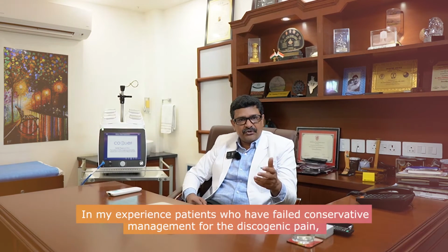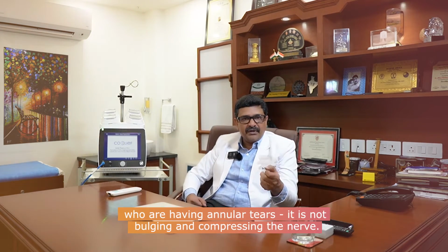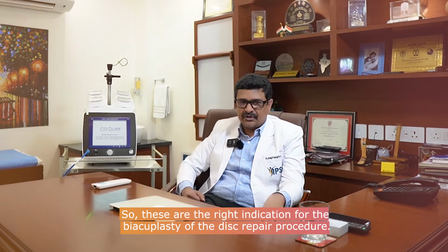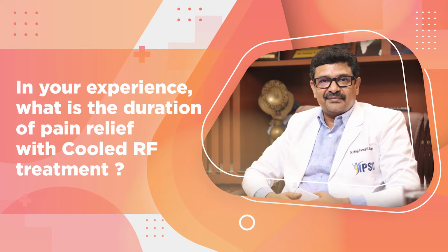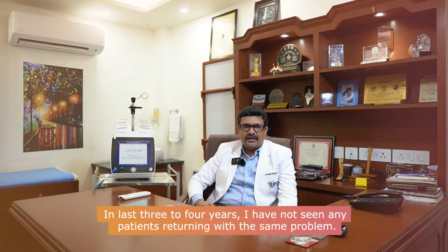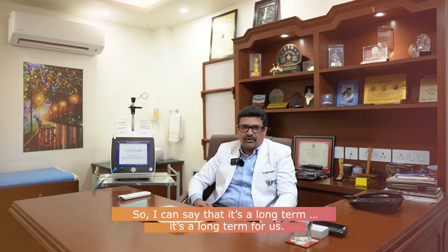In my experience, patients who have failed conservative management for discogenic pain, who are having annular tears, where the disc is not bulging and compressing the nerve, these are the right indication for biacuplasty or the disc repair procedure. I have not seen any patient who has come back with a similar kind of pain or similar complaints. In the last 3 to 4 years, I have not seen any patient returning with the same problem. So I can say that it's long term for us, yes.